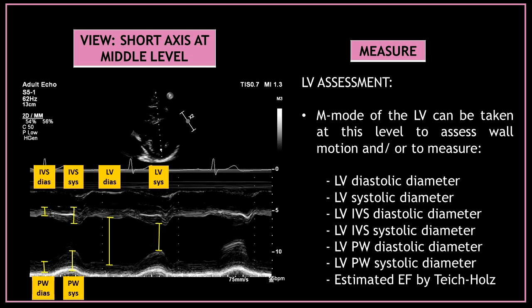You can also use M-mode to assess the left ventricle at this level. M-mode of the left ventricle can be taken here to assess the wall motion and to measure the diastolic and systolic diameter of the left ventricle, the diastolic and systolic diameter of the septum and posterior wall, and the estimated ejection fraction by the Teichholz method.